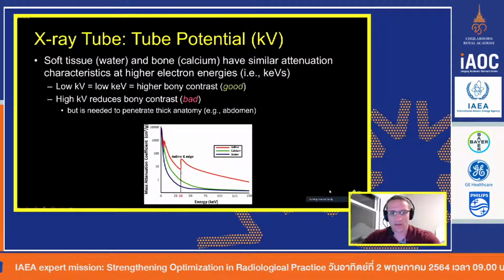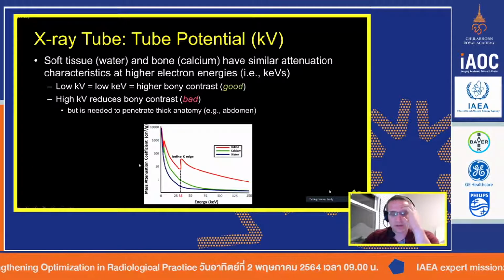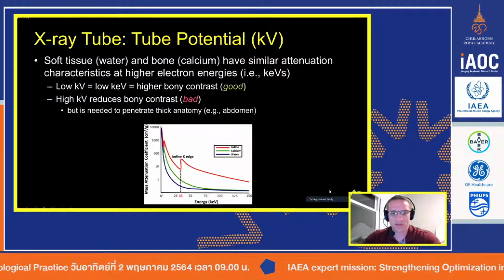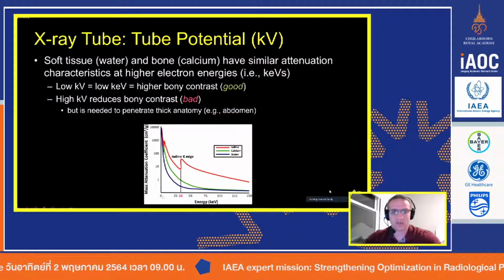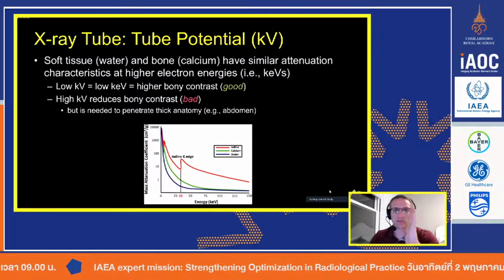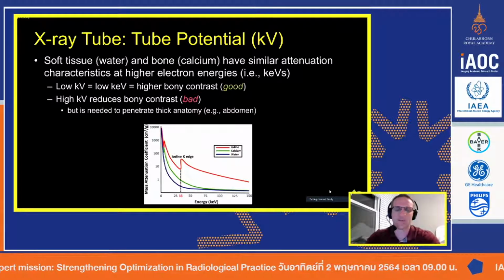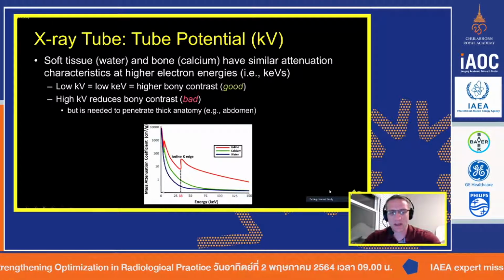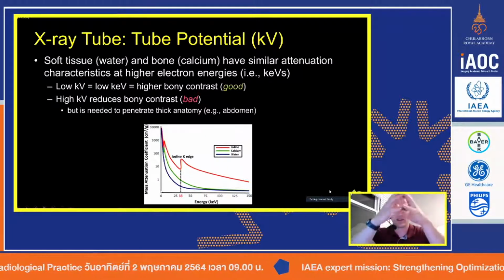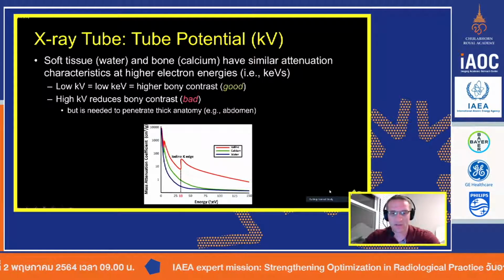We've got here on this plot the attenuation coefficient, or the amount of attenuation, of these three objects. Obviously low attenuation versus high attenuation. Low attenuation means the photons will just fly right by and won't interact with the object or material. High attenuation means they stop, interact, and get fully absorbed. And the amount of attenuation that happens in our body depends on the energy of the photons coming out of the tube. And remember, that's why the units are in keV.